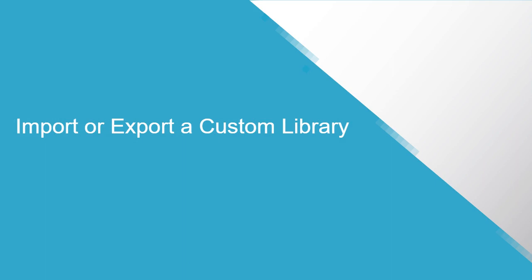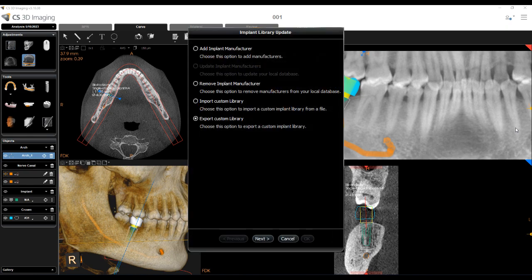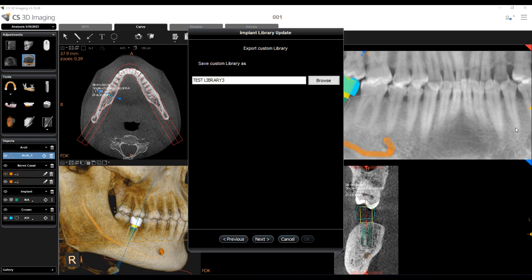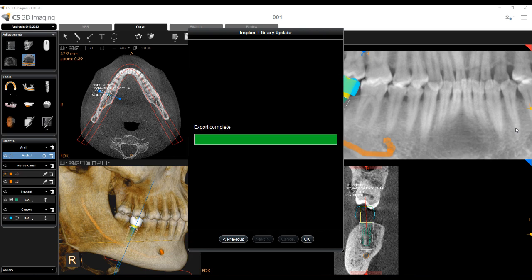Import or Export a Custom Library: You can only export implants you have created — you cannot export manufacturer's implants. The exported library will be saved in zip file format. Open the implant library update window, select Export Custom Library and click Next. Click Browse and select the folder in which you want to export the zip file, and enter a name for the zip file. Click Next. The file is exported. Click OK to finish, or Previous to return to the Options menu.